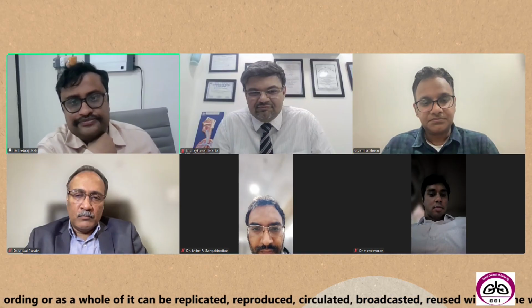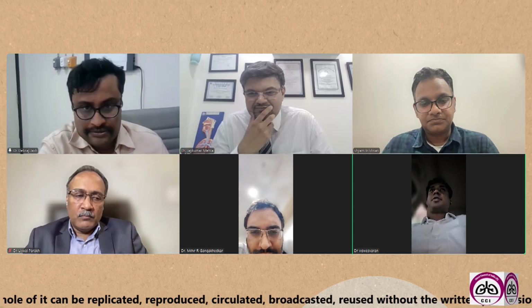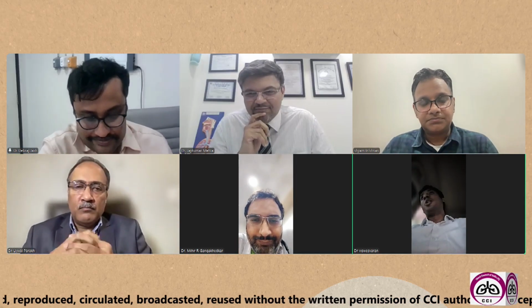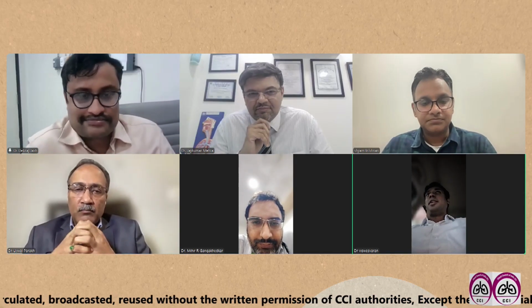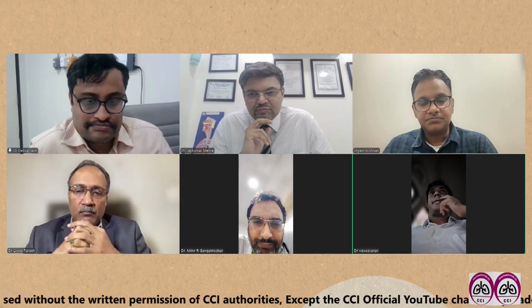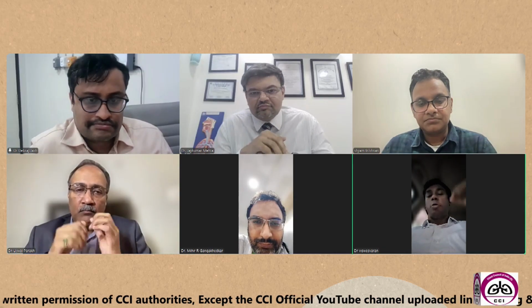Vishwesh, Mihir, any comment? I have never done a transvascular, and I always try to look for whichever is the safest one. There were a couple of instances where we had a node behind the aorta, and sometimes you have to go through the esophagus.